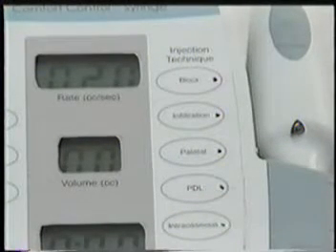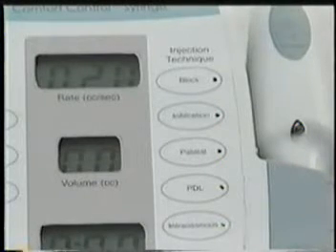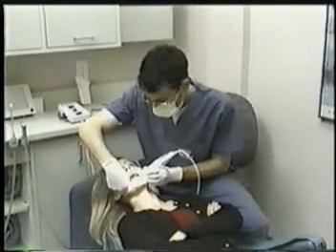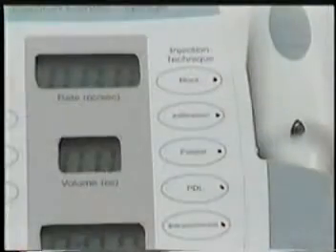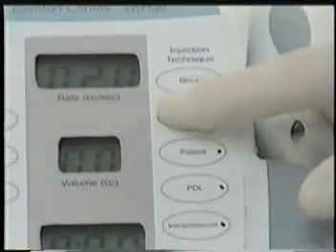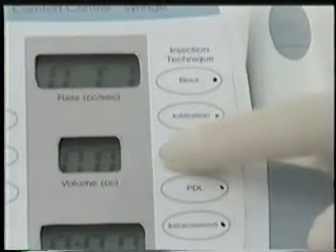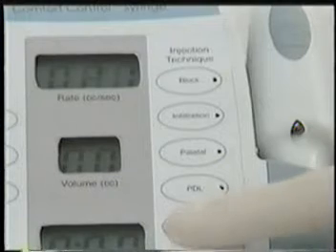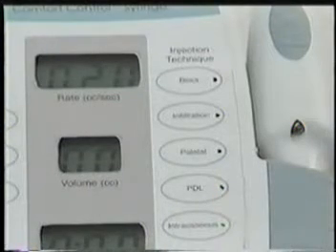These injection technique selections on the CCS are intended only to be a convenient guide to selecting an injection rate. Your clinical judgment should always prevail in selecting the appropriate rate for each injection. To select a rate, just press the appropriate button. The indicator light will show which injection mode you have selected. When in operation, the digital readouts will display the rate, volume, and elapsed time of the injection you are administering.